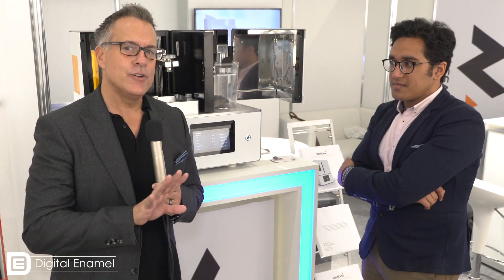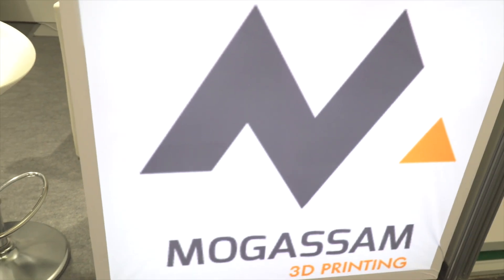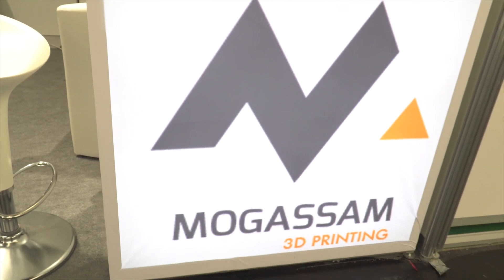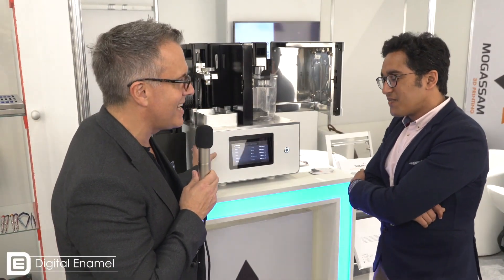So there's a new line of printers coming out that have automated the post-curing process. You print, you move the build plate over to a wash station, and then you move that over to a curing line. So I'm here with Ahmed, and we were talking about the Dent case printer. Ahmed, tell me about this whole situation.